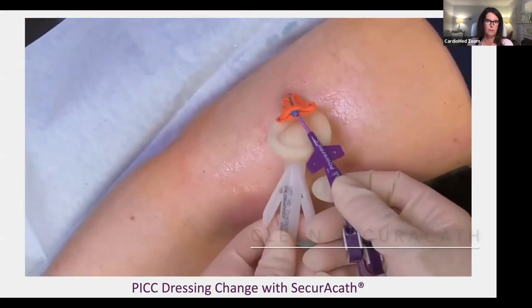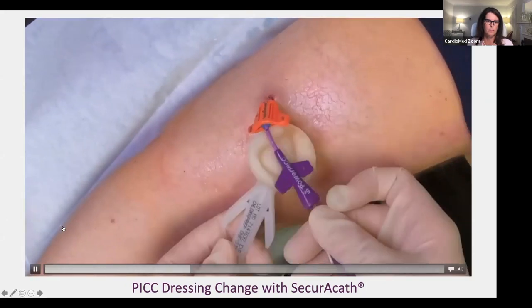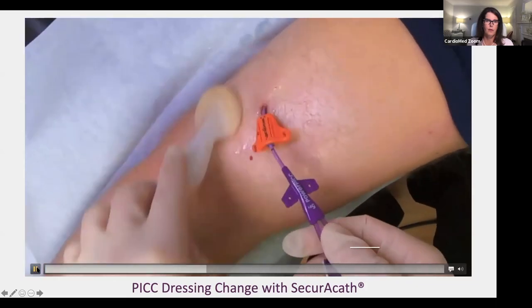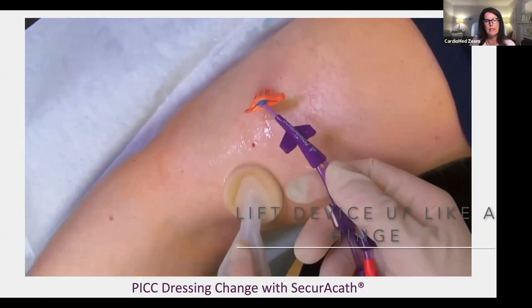Gently lift the catheter and the SecurAcath. Clean the insertion site and SecurAcath with cleaning agent. Do not twist or rotate the SecurAcath during the cleaning process. So that's a couple of important points here. But when you do lift it, you just lift it straight up. You're not bending it. You're not twisting it. And the beauty of this is that because you can lift it up, you can clean right up underneath the device and make sure you clean the bottom of the device as well.